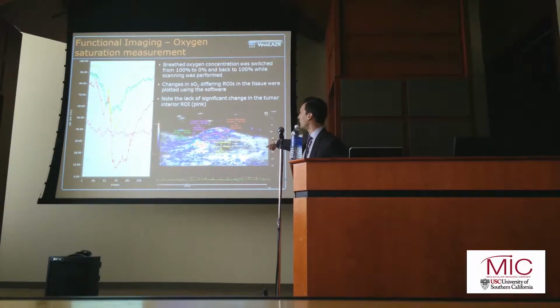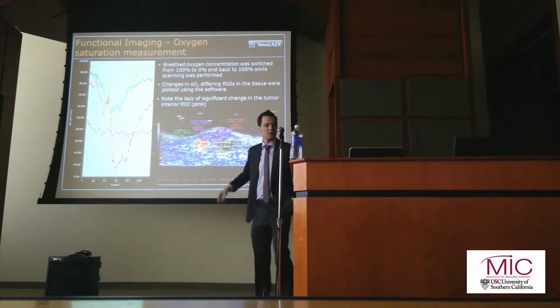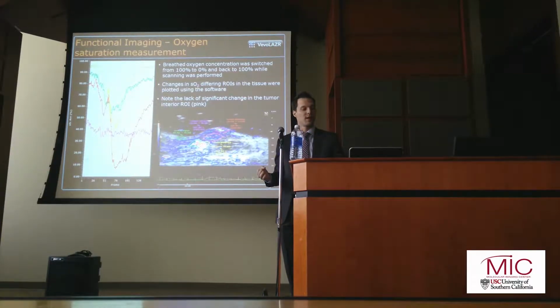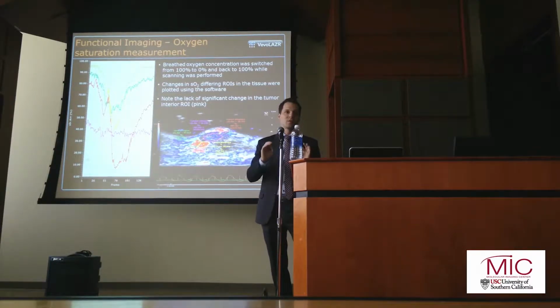And this is our oxygen saturation image. So you're looking at a blue and red and white color map here. If you look over to the side here, you'll notice that the red is 100% oxygen saturated blood, down through the white into the blue, which is less oxygen saturated blood right down to 0. So now we've got this parametric, high resolution map of oxygen saturation in vivo.